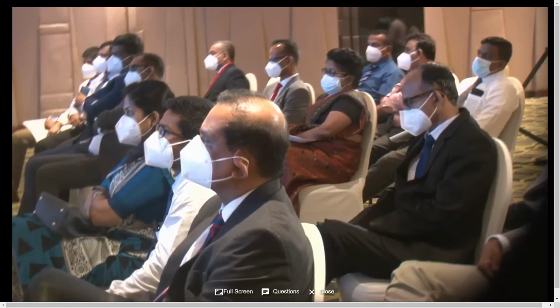Selection is, I think we all, as interventional cardiologists, follow the rules to protect the side branch. Comparing DK crush and culotte, in DK crush we always keep the main vessel wire as it is, and in culotte we are always changing the two wires and crossing the side branch and the main branch two times. DK crush has two-time kissing and a few more steps, but it better preserves the side branch, the carina angle, and there is less displacement of the plaque.